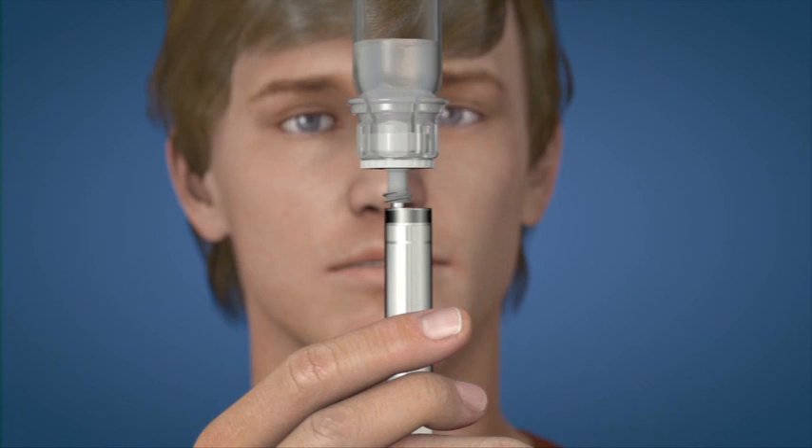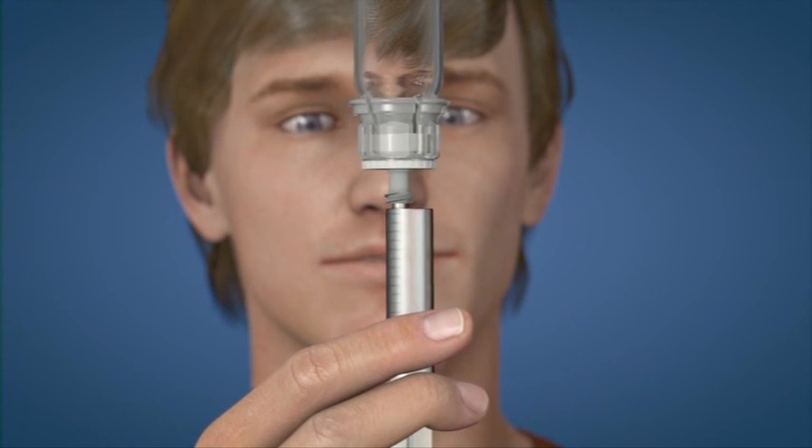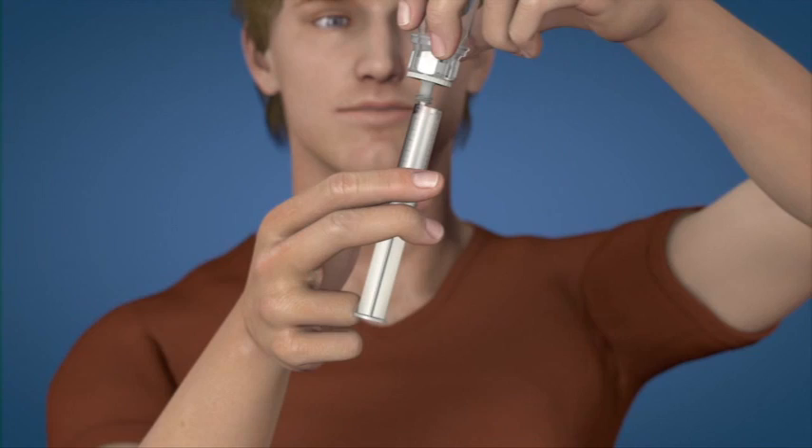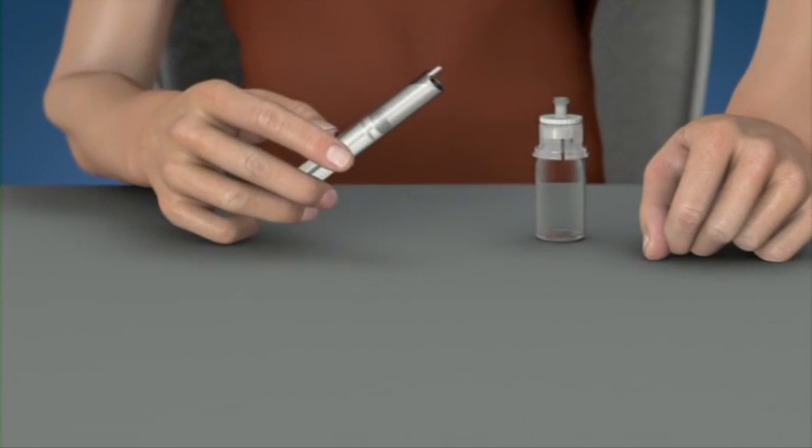While keeping the syringe plunger pressed, turn the system upside down and draw the reconstituted solution into the syringe by pulling the plunger back slowly. Now that the reconstituted solution is in the syringe, firmly grasp the barrel of the syringe, keeping the syringe plunger facing down, and disconnect the Mix2 Vial set from the syringe.